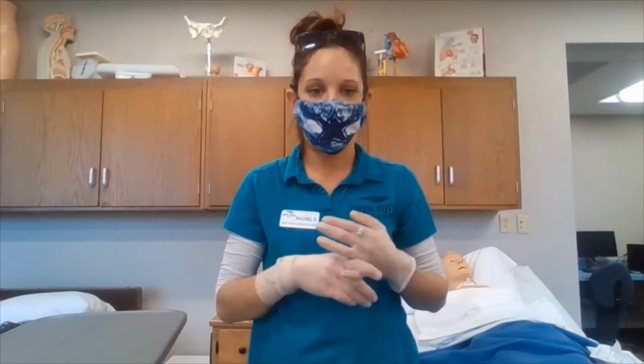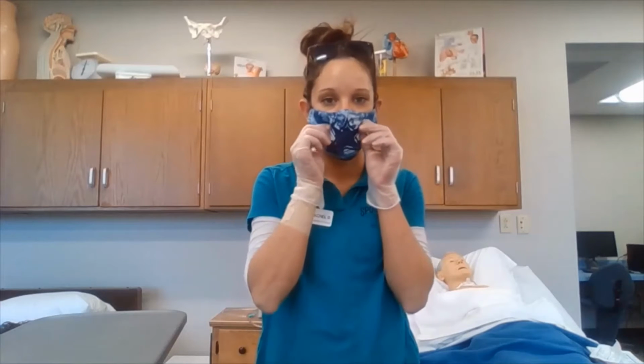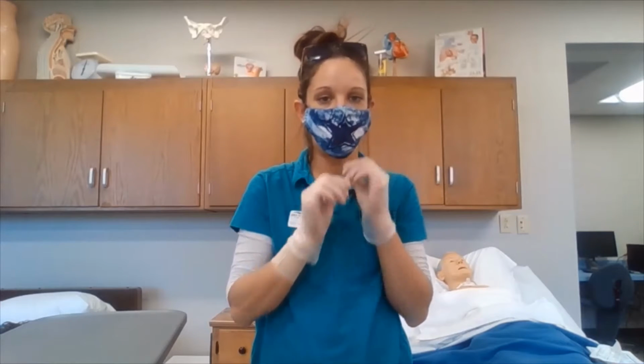Then we're going to be assessing for nasal patency. We are also going to be asking the patient if they've ever had any nasal or facial surgery or reconstruction. We're going to ask them if they have a deviated septum and if they've ever had an NG tube inserted before.